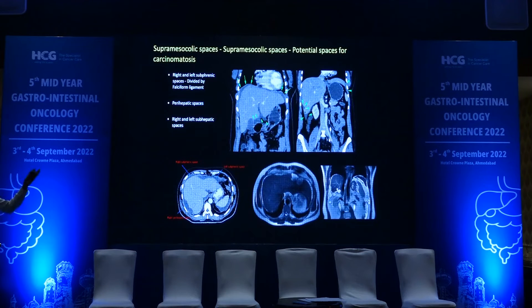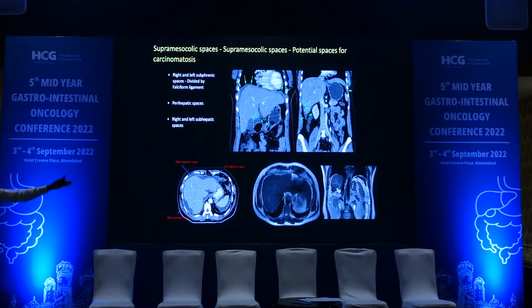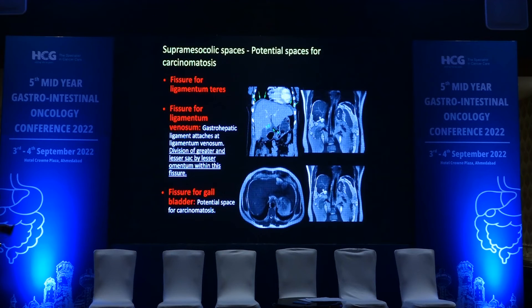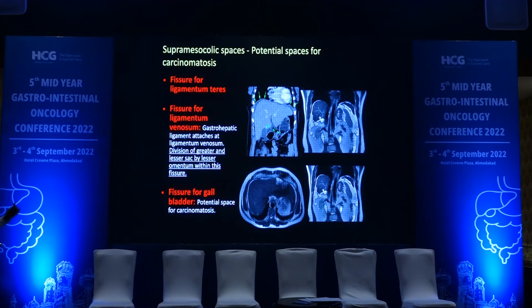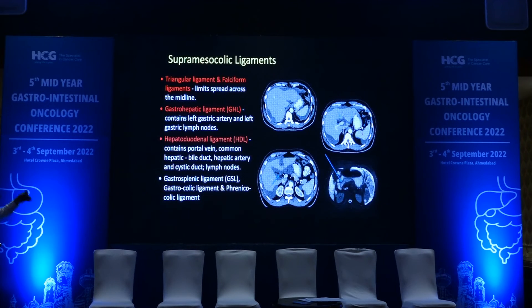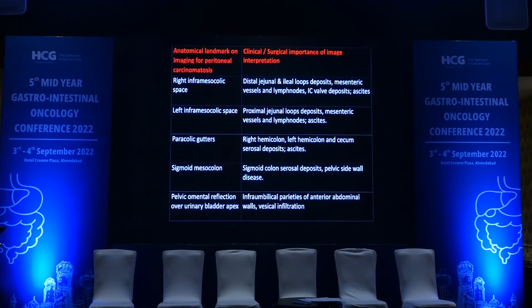These are the corresponding images showing right and left sub-diaphragmatic spaces, right and left sub-hepatic spaces, and the corresponding MR images where you can better see the mucinous component — fluid, mucin, and septations are clearly differentiated. The two most important fissures are: the fissure for ligamentum venosum, where the division of greater and lesser sac by the lesser omentum occurs, and the fissure for the gallbladder — a potential space for carcinomatosis.